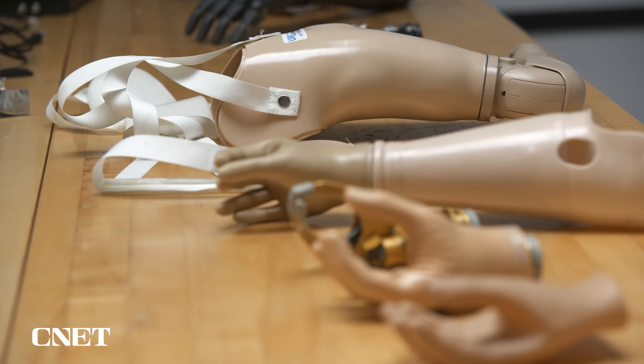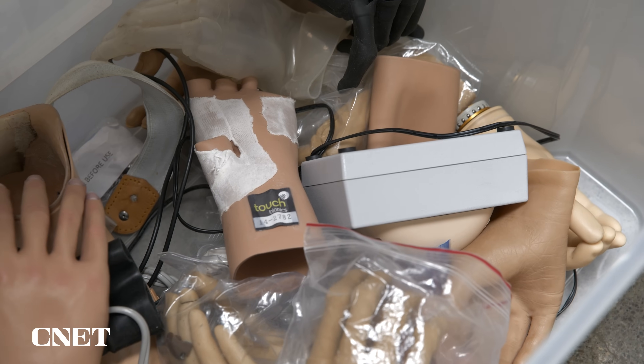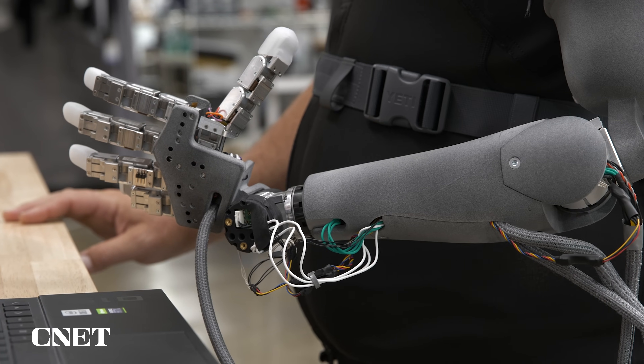With other prosthetics, you generally have to get individual parts like an elbow, wrist, and hand from different manufacturers. Then a prosthetist puts them together. The Atom Touch is a whole arm with a battery and all the compute power in the forearm.